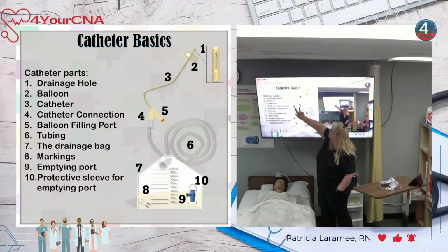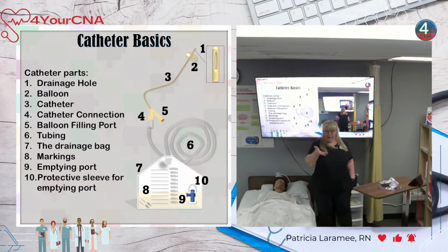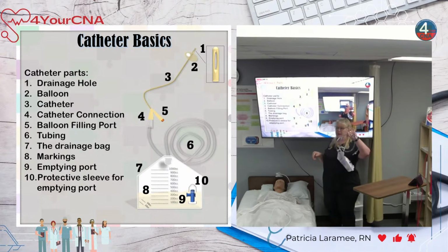Now at the bottom, you have these two terminal ports. One of them is where we put the water in and take it out. The other one is going to attach to some sort of a collection device. We got to collect that urine that we're diverting out of the bladder. So it connects to some sort of a bag. That's what I have here. This is the bag that you'll be using on the state exam.